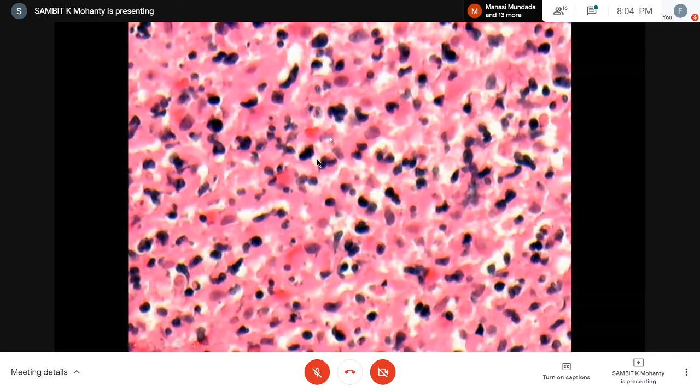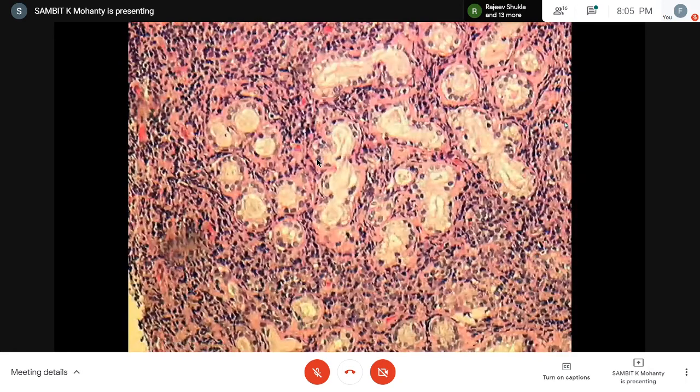And same thing, you have neutrophils, nuclear dust, and these cells, some having moderate cytoplasm, some having little cytoplasm, and they're hyperchromatic. These are endothelial cells, the cells with the vesicular nuclei. I would say not vesicular, they're kind of a smudgy nucleus, and this big cell. And these are the normal ducts, and they are kind of expanded. The stroma is expanded in between by this cell.